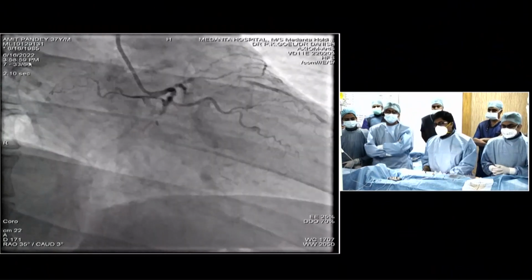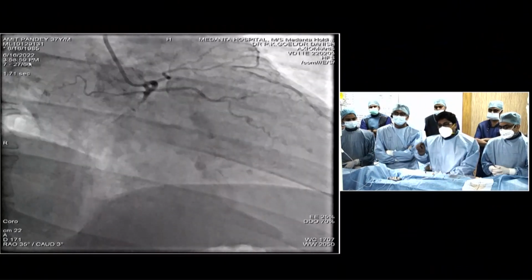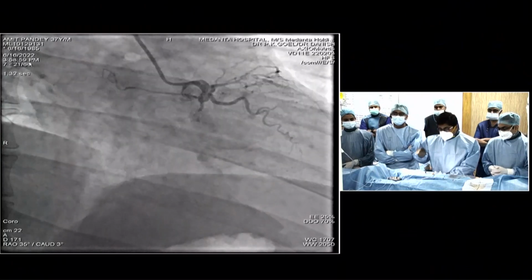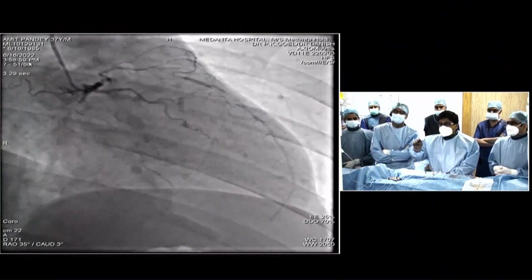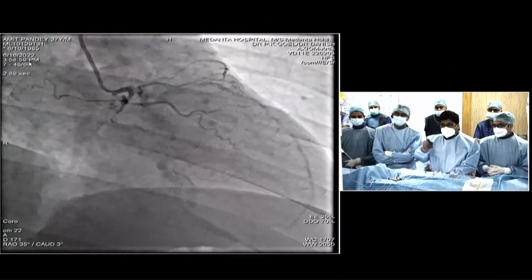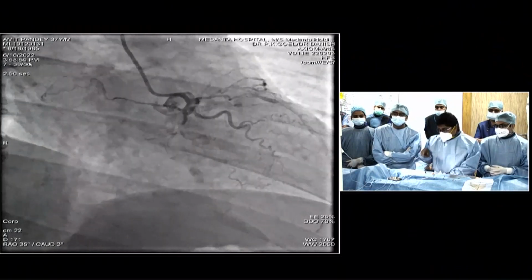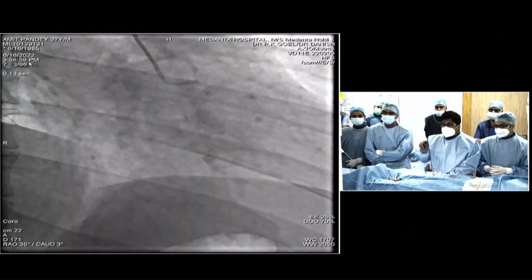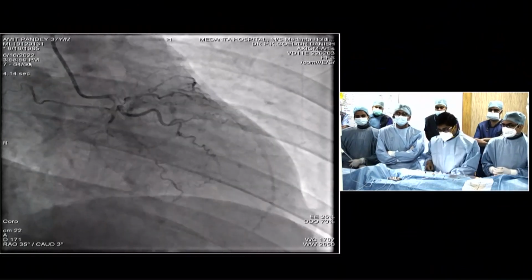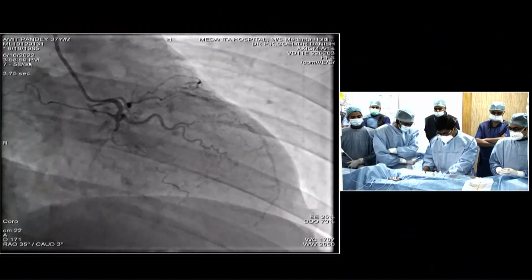No, that is what I wanted to bring out. The thing is, when you are working on these CTOs, sometimes you start reducing the flow through one source, and then there is a problem. And the other thing is, the in-between segment, if you see the angiogram well, actually fills through the right collateral only. So now we'll show a bilateral injection, which we have just done.